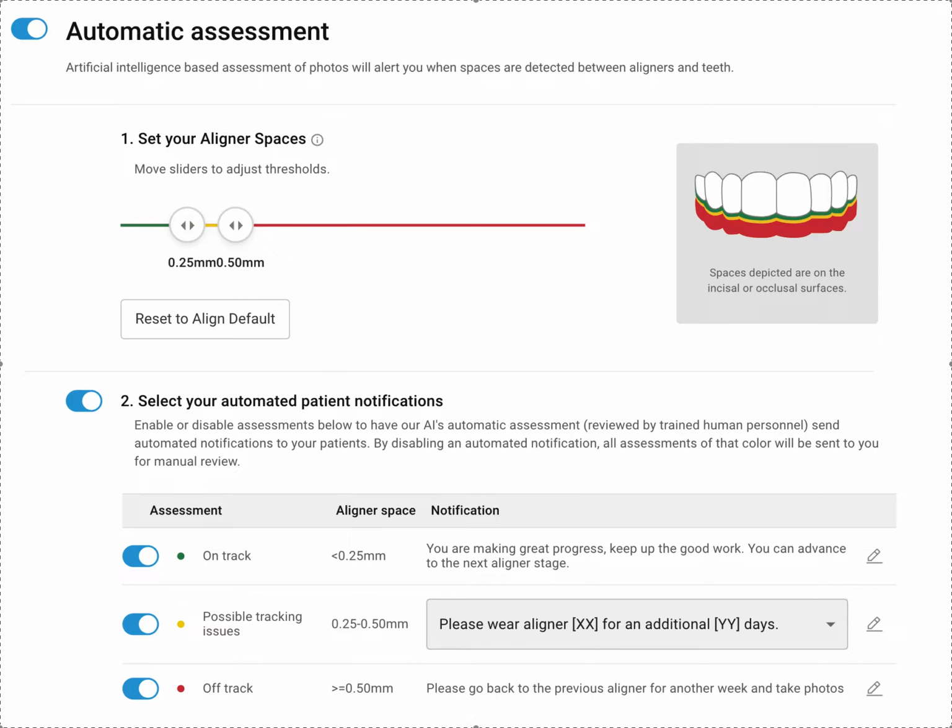You do need to buy the branded retractor. It's in the Invisalign store. Last I checked, it was literally less than $1. It wasn't a big deal. That's the only thing you have to buy.